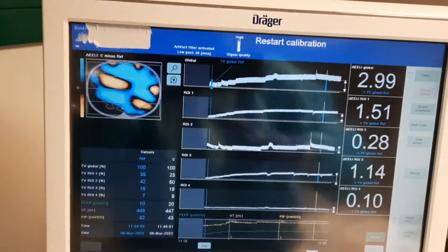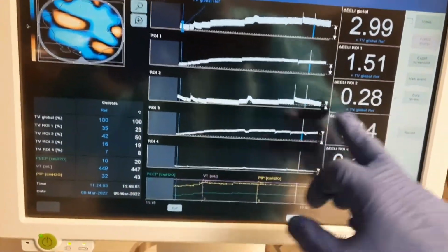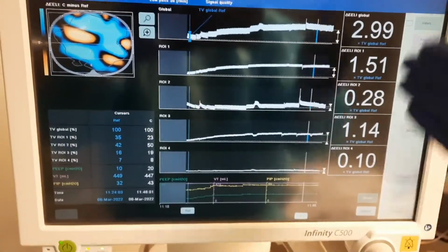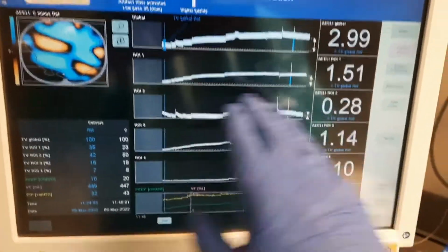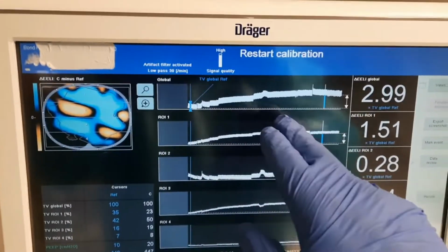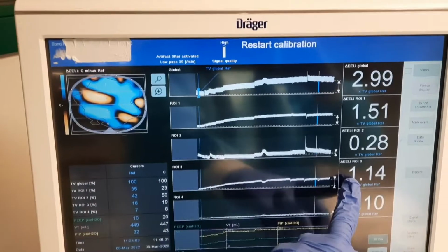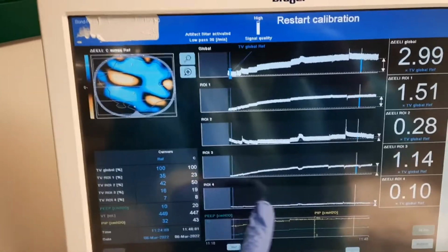With the patient's size, my big concern is over time atelectrauma occurring in these regions. Functional residual capacity: impedance equals tidal volume. More impedance, more volume, less impedance, less volume. Therefore, right away you see that all of these are positive. We are recruiting at all levels of ventral to dorsal. Unfortunately, the majority is up here in the ventral region. I like the fact that over here there's 400 tidal volume more at the end expiration, and this would be very minimal, like 40 cc's. Well, 40 cc's at the dorsal region is better than nothing.